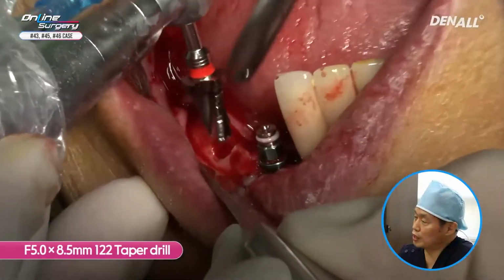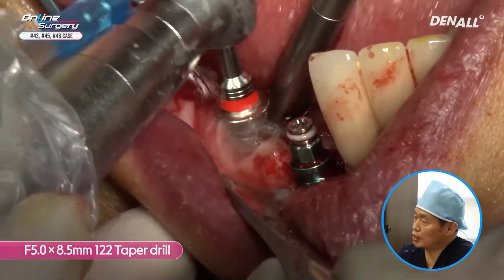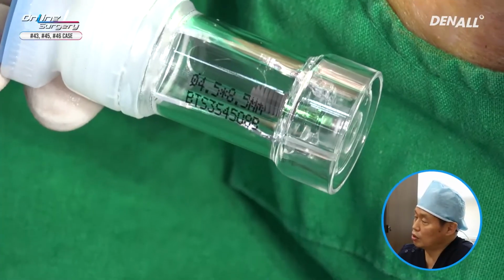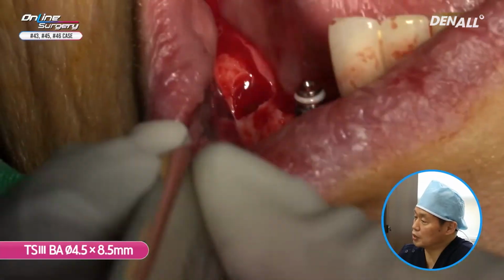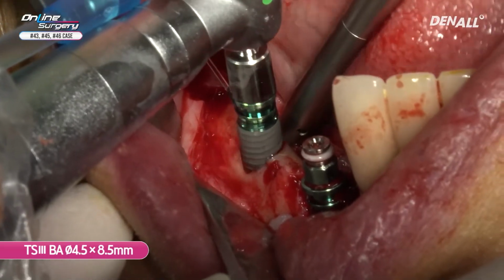The bone quality is quite hard, so a 5.0 by 8.5 drill is used. It's not full length, but approximately 70% drilling is done, and after that, I'm going to place a 4.5 fixture.